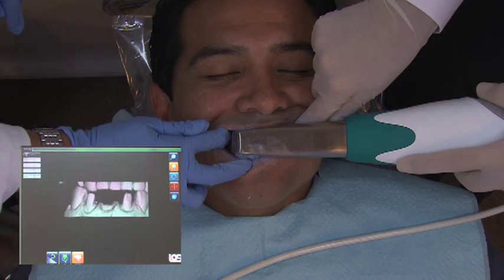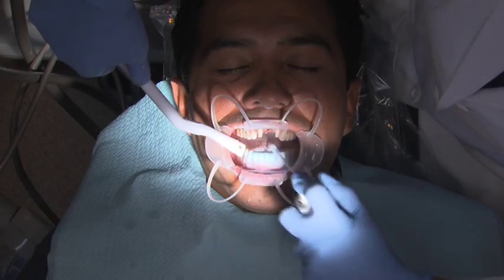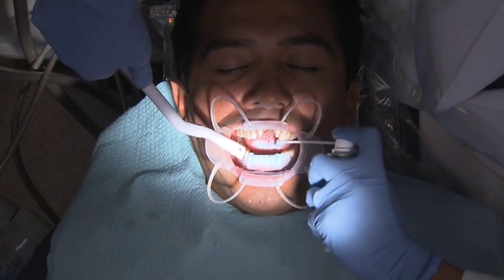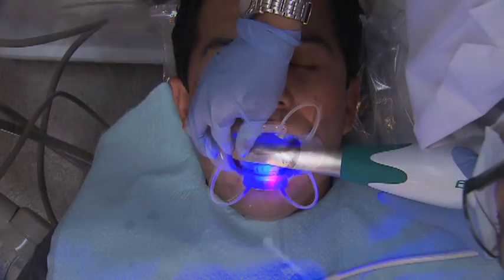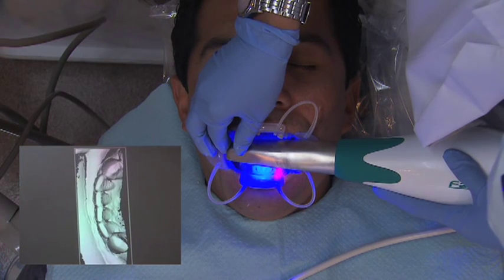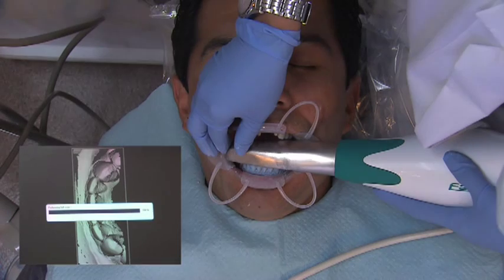We powder the lower teeth, the patient bites together, and I scan the bite — just one scan from the facial — to get the relationship between those two teeth. And I'm done. I leave the room at that point. My assistant is going to powder the opposing teeth and do those same three scans: incisal, lingual, and facial.